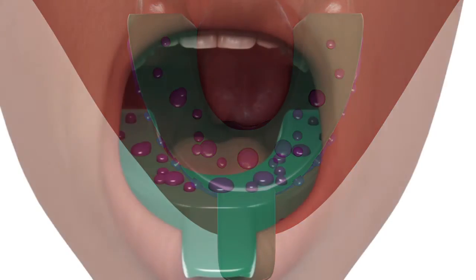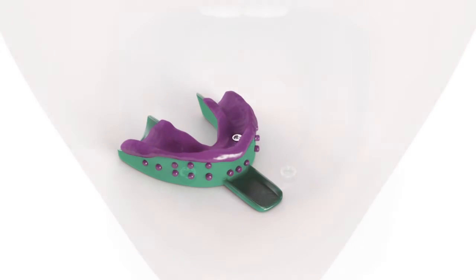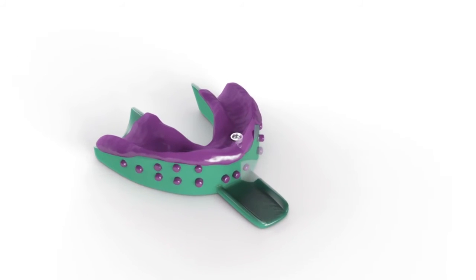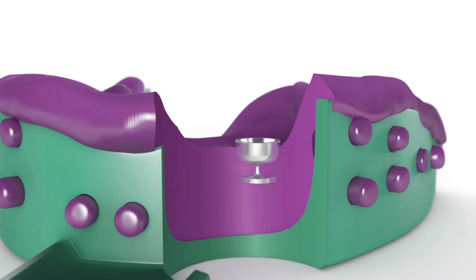Once the impression material has set, remove the tray and the copings will be picked up in the impression. Verify that the impression material is completely adapted around the locator coping.